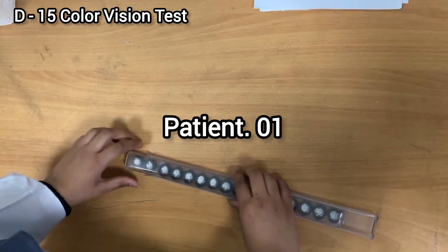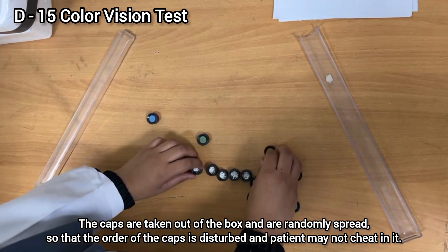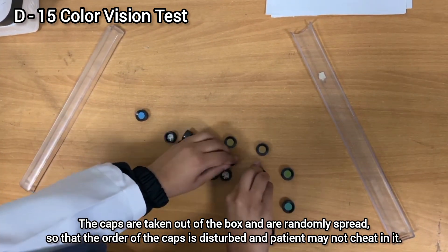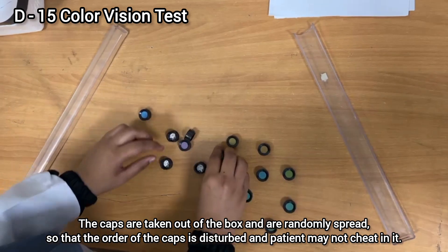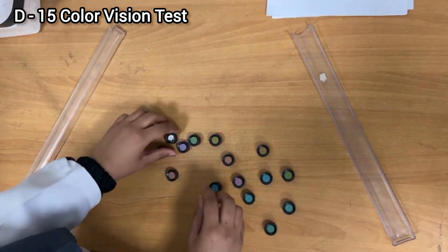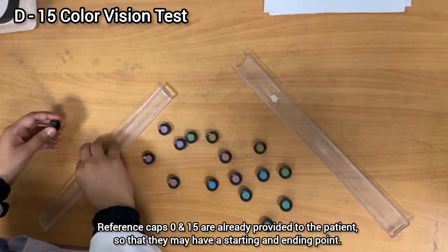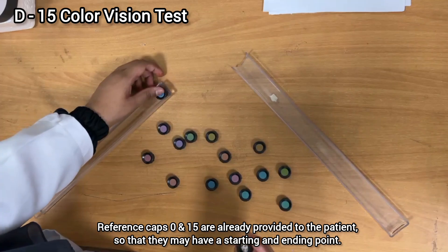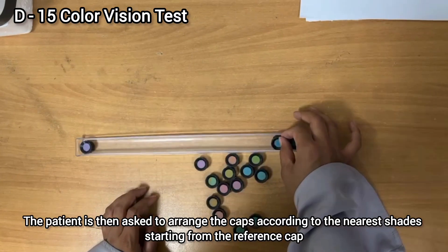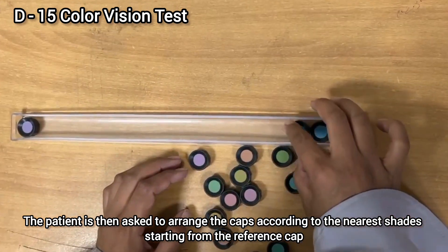D15 is a type of color vision test used to check a person's ability to discriminate different shades. It identifies color vision defects such as Protanopia, Deuteranopia, or Tritanopia. Every defect — red-green and blue-yellow defects, whether congenital or acquired — can be checked by this test. The test has 16 caps that need to be arranged according to their hues or shades.